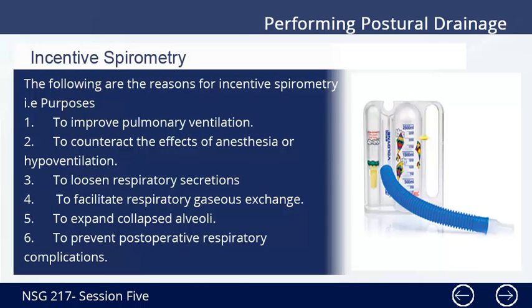Incentive spirometry. Incentive spirometry means assisting the patient for voluntary deep breathing by providing visual feedback about inspiratory volume by using a specially designed apparatus called a spirometer. The following are the reasons for incentive spirometry, that is, purposes. 1. To improve pulmonary ventilation.